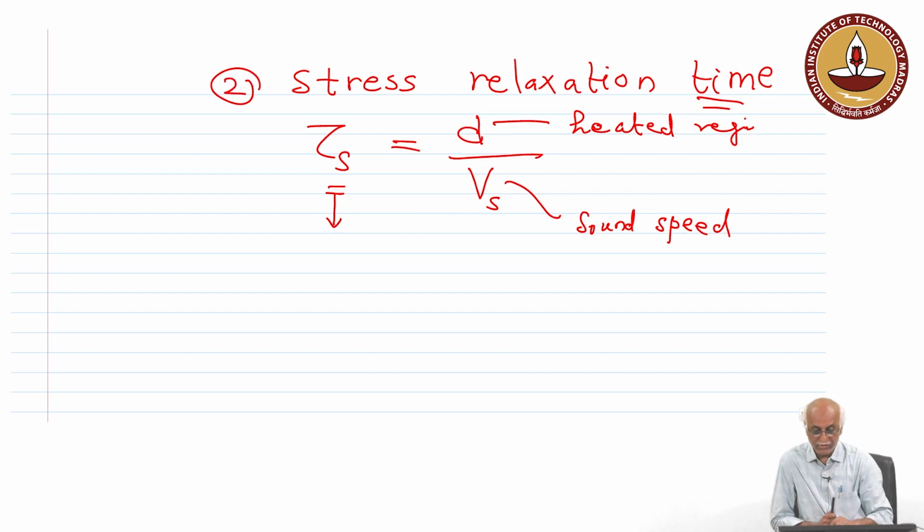Thermal relaxation may be of the order of microsecond to millisecond, we will estimate it approximately, and the laser pulse which is used should be shorter than this. Otherwise there will be a cumulative effect of the laser pulse interacting with the tissue while relaxation is simultaneously taking place.